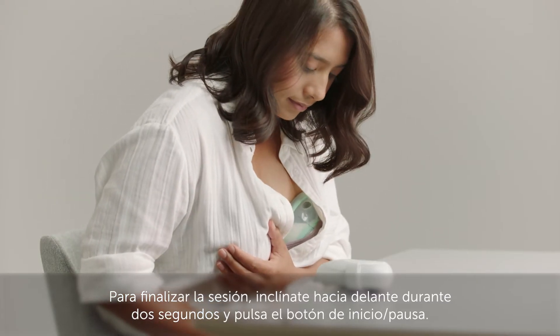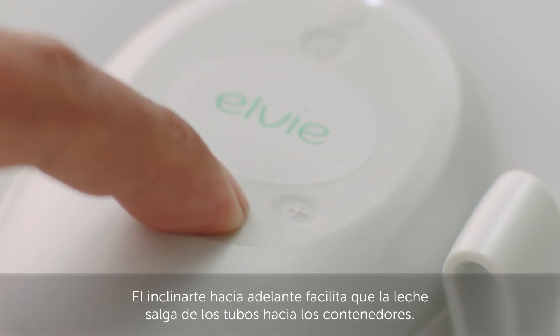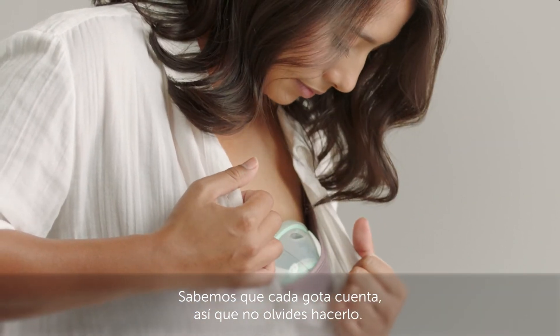To end your session, lean forward for 2 seconds and press the play pause button. Leaning forwards helps milk drain from the nipple tunnels into the cups. We know every drop counts, so don't forget to do this.